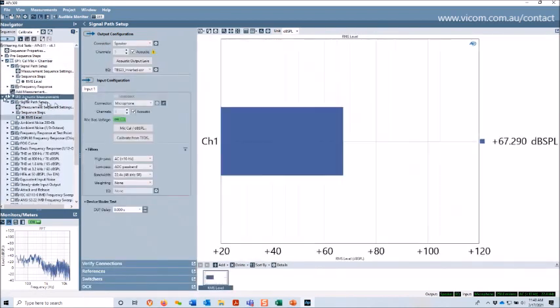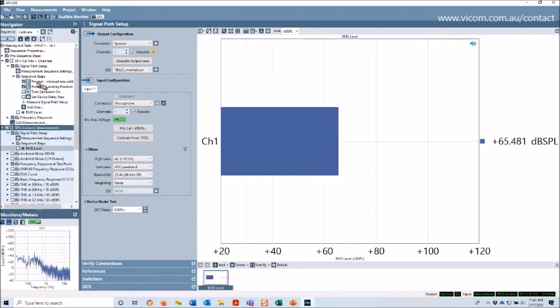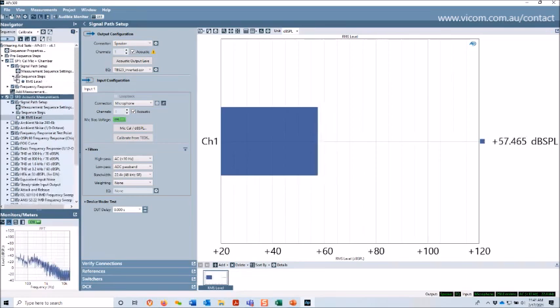Now, you may notice that there are a series of checked boxes here, and the navigator is actually a sequencer. And when I hit this play button or run sequence button, it will step through and execute all of the checked boxes. So any measurements that are checked will be executed. And inside here, there are some sequence steps that also put up prompts and so on. And any of those that are checked will be executed as well.